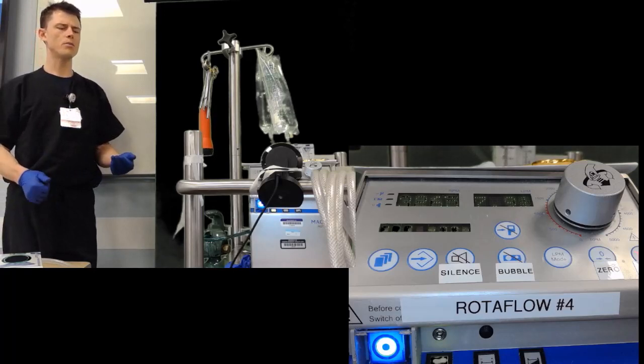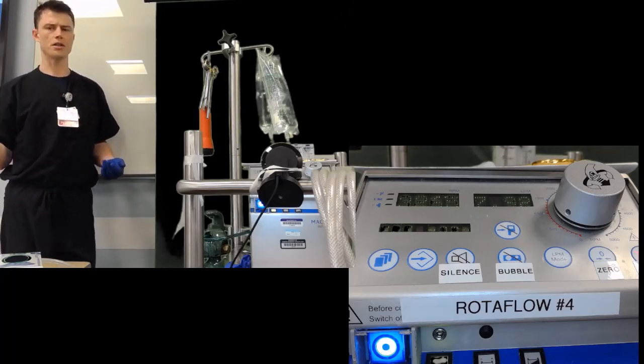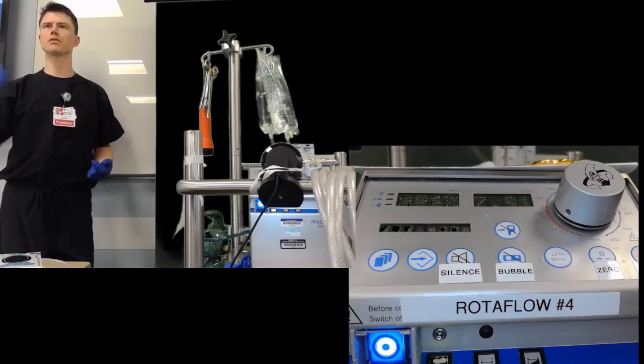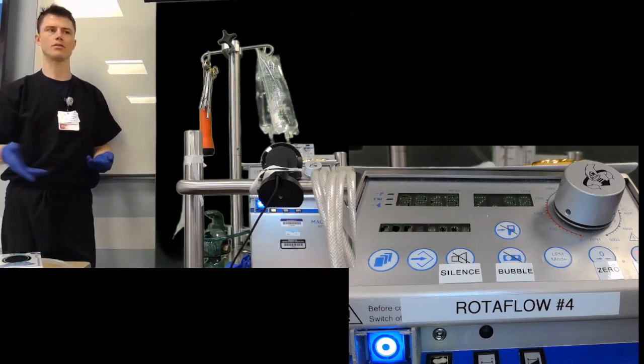And we had a patient, I think it was in bed 21 actually, where they were using a Foley that was supposed to sense temperature, and once they changed that out, the temperature was not high. He was having fevers and we couldn't figure out why because the warmer seemed to be working.